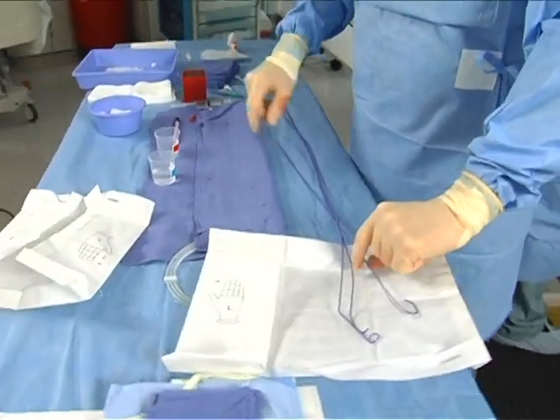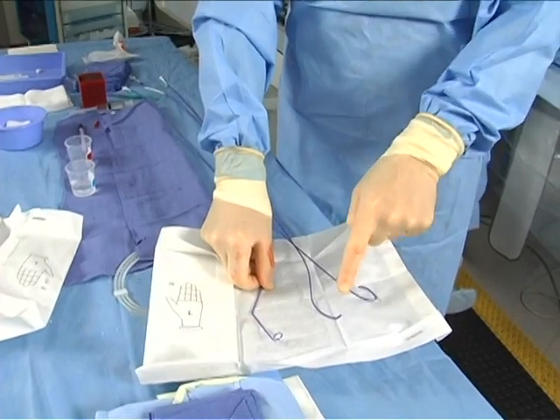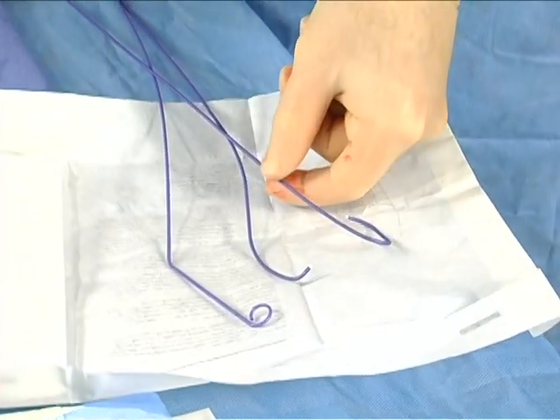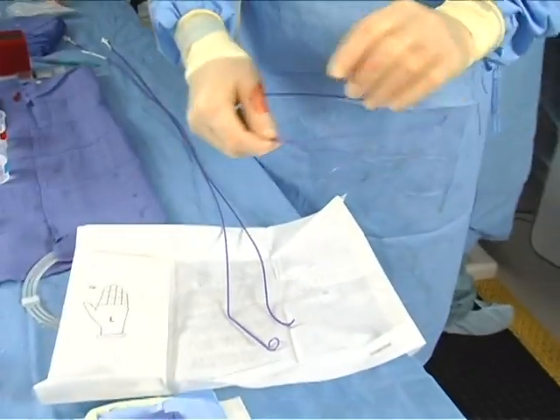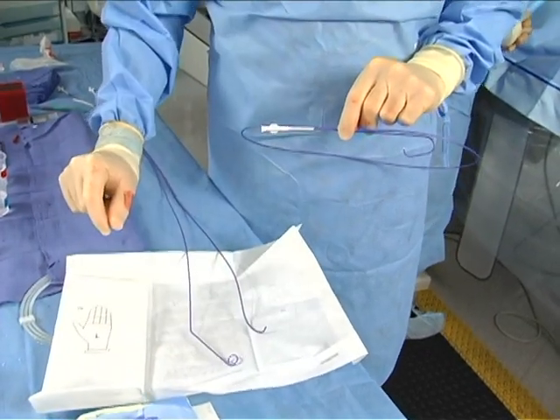So these are the catheters we use for routine coronary angiography. This is called the left Judkins, right Judkins curve, and a pigtail curve for obvious reasons. We're going to start with our coronary catheter, left Judkins, and introduce this, change it out for the right Judkins, and lastly for the pigtail catheter.